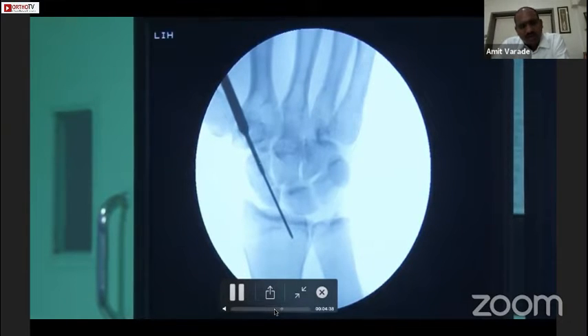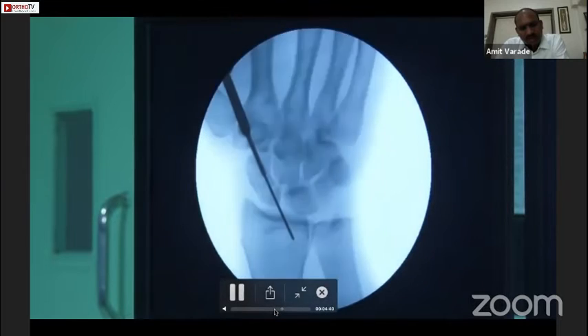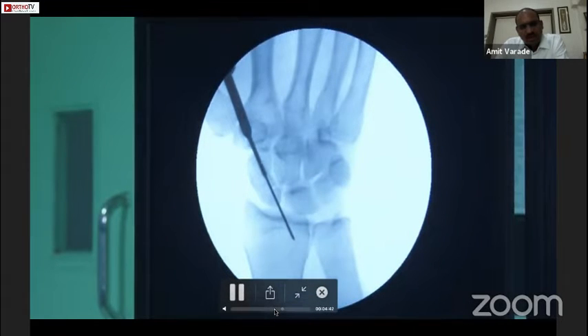One important thing: once we put the guide wire in the radius, we have to keep the same wrist position, otherwise the guide wire will break — which is a very difficult situation requiring the wrist to be opened to remove it. Now we are crossing the fracture site.